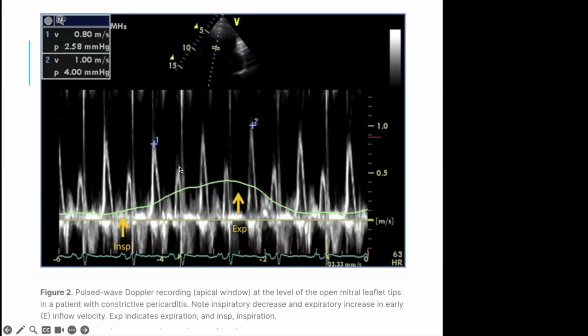It seems like it's the lowest velocity here, but maybe Dr. Chow can comment. Oh, I see. Yeah. Typically, we choose the lowest one and the highest one, right? As a combination, because there's often a phase lag in the inspiration and the expiration phase. But obviously, having the respirometer is really important. Right. Yeah. So we can see that our expiration is here, inspiration is here, and using our calculation, we get a value in terms of the variation change.